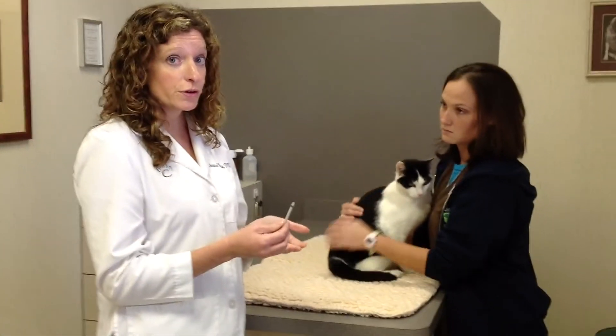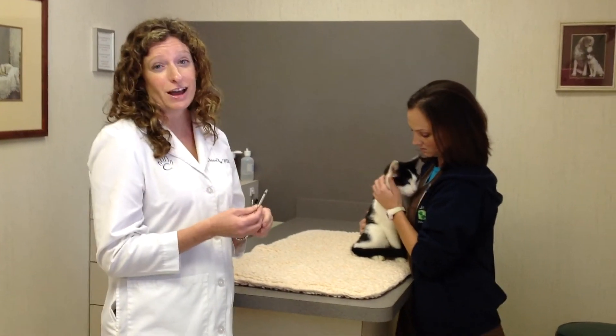Many of my clients prefer to do this while their pets are eating, which is completely fine. Most pets do not seem bothered or even unaware that they have gotten their insulin injections.